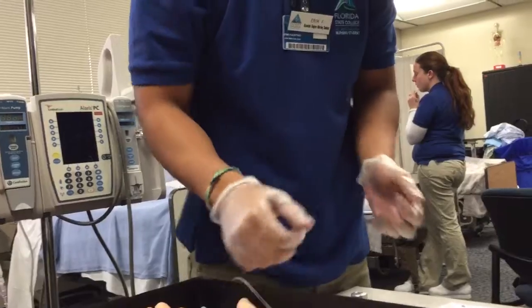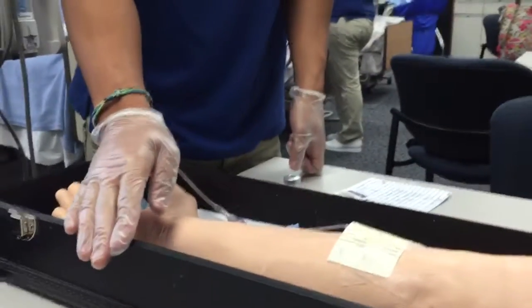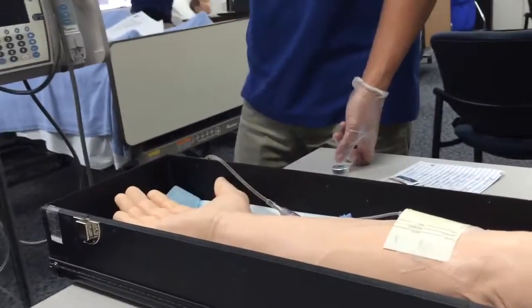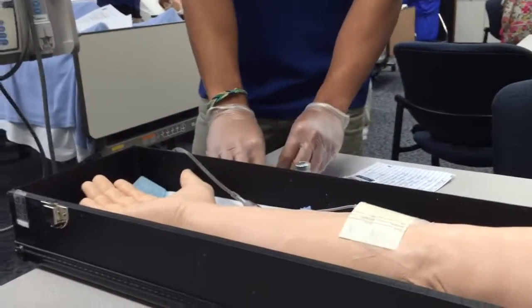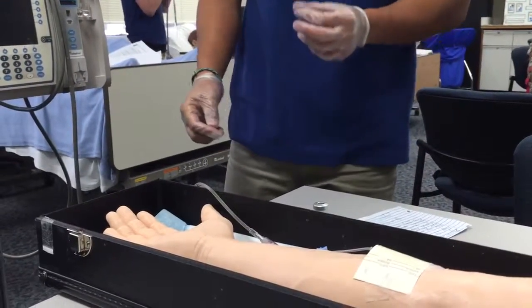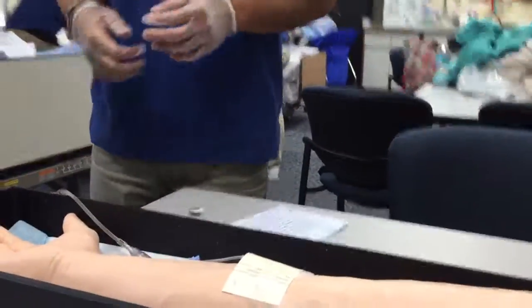It's running through. There's no signs of edema or any infiltration or anything, no phlebitis. The vein still looks good. So now the piggyback is running through the primary saline line, and I'm going to go ahead and let that run now. I can go ahead and dispose of all my unused supplies, and then I'm going to go ahead and take my gloves off and rewash my hands, and then that's the end of that part.